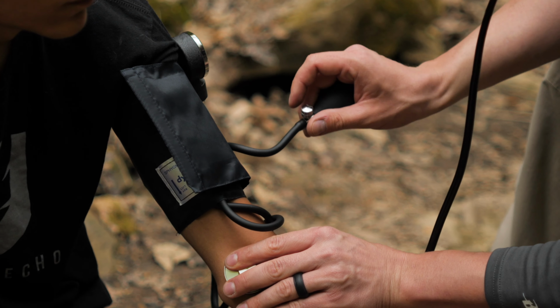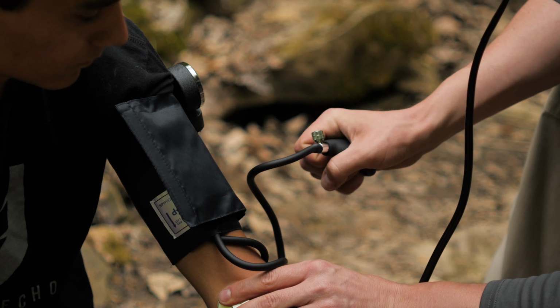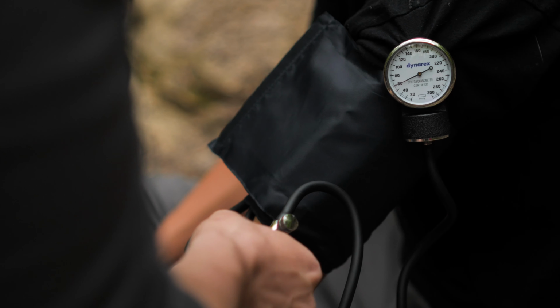I'm going to tighten off the valve here and I'm going to pump this up. I'm going to start at about 160. If you inflate this to 160 and you put your stethoscope down and you hear a bounding heart rate, you've got to go higher. You need to go higher than the pulse that you're hearing. So you've got to completely occlude that artery before you can actually start taking that blood pressure. So keep going, give it a couple more pumps, keep going up until you get to the point where you can no longer hear that pulse.